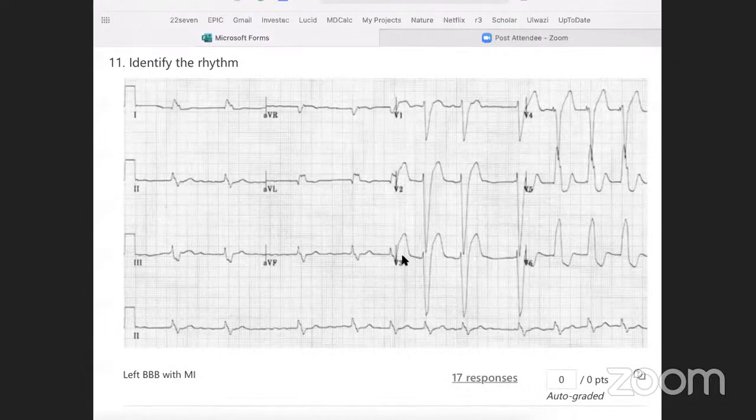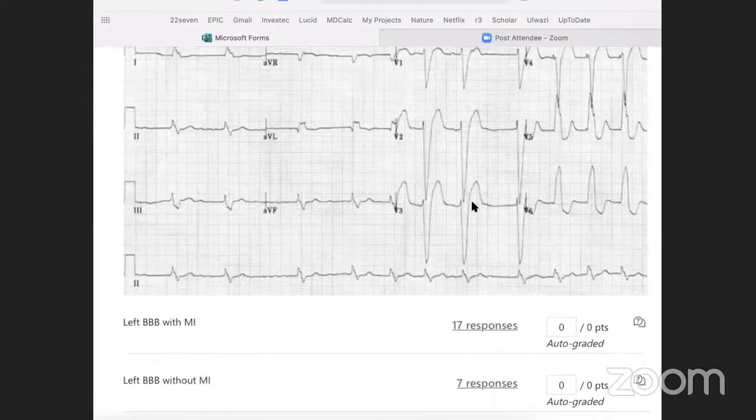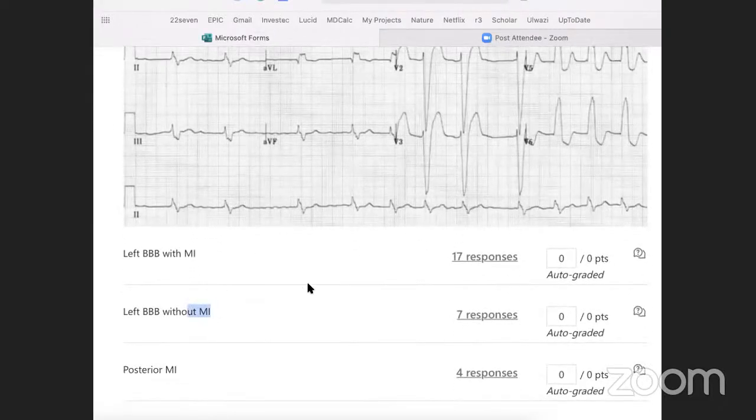Alrighty. So there are some really tough ECGs here. And this would be a left bundle branch block as well. So we can see that this is atrial fibrillation with the left bundle branch block with no discernible P waves preceding any QRS complex. So it's irregularly irregular, and then the very wide and bizarre QRS waves. But these are discordant, but not excessively discordant. And there's no concordant ST segment depression. And so this is just a left bundle branch block without MI.